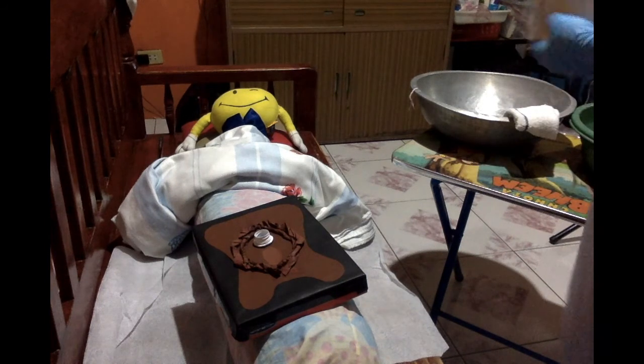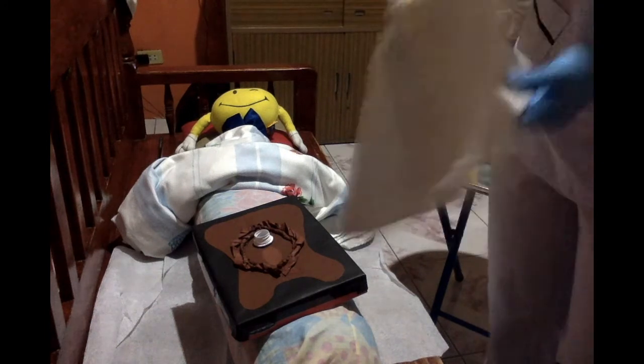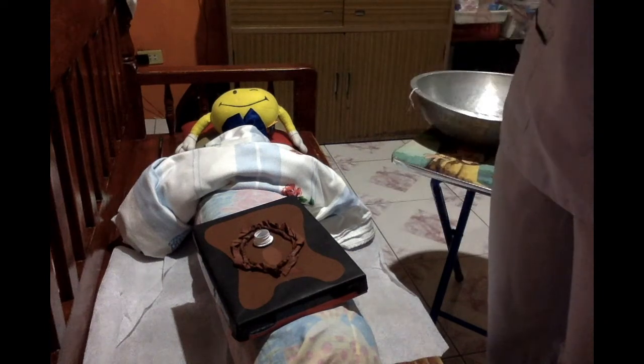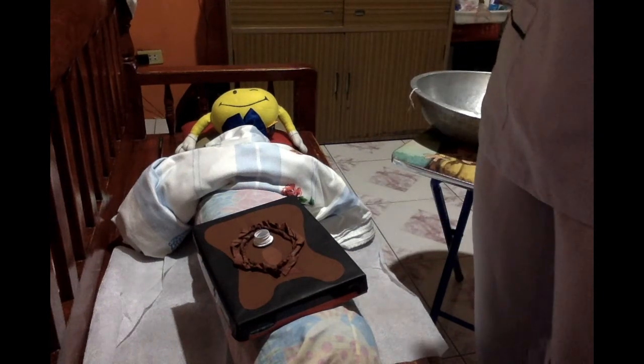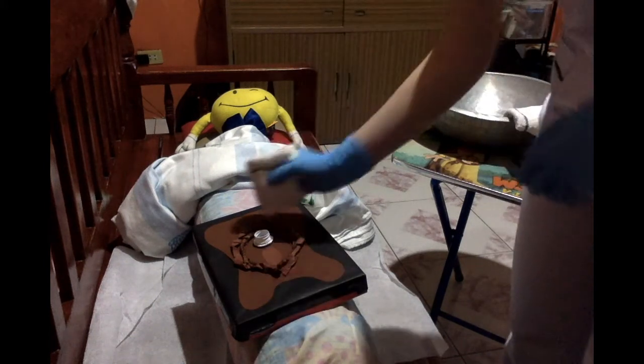After rinsing, we will now pat it to dry. So this is the third towel. Remember, in drying, we must not wrap it. We should just pat it. Like this.